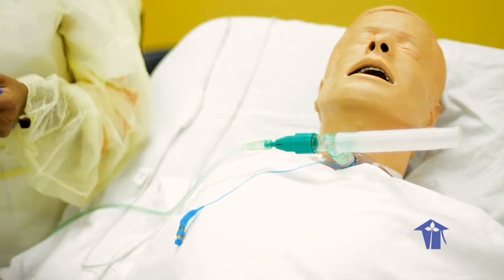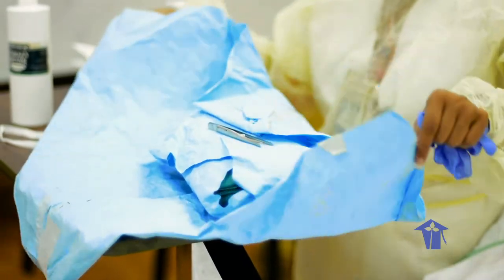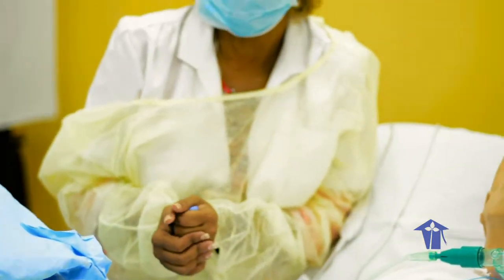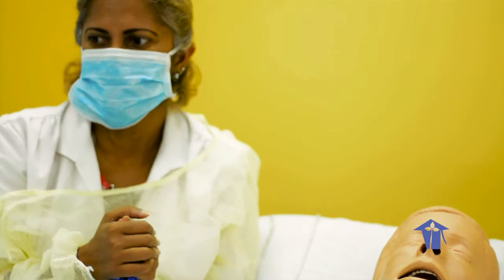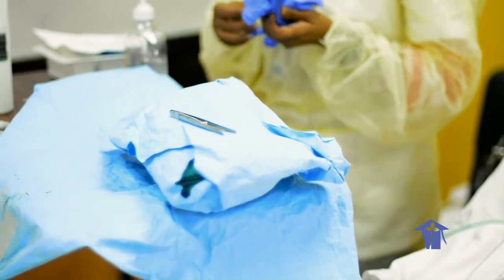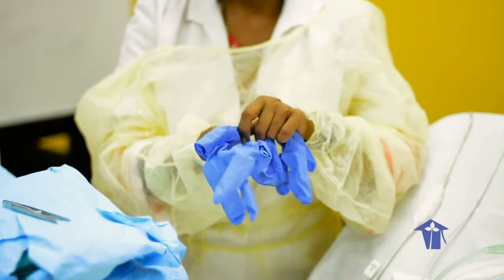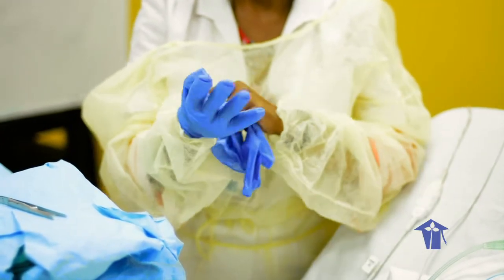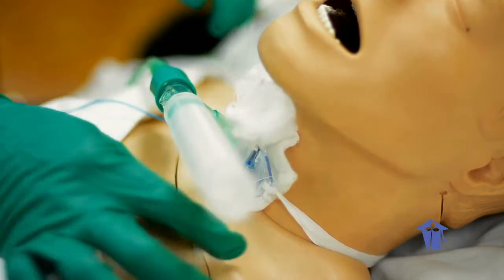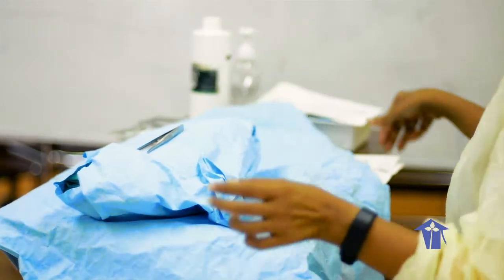Carefully open the package with the new disposable inner cannula, taking care not to contaminate the cannula or the inside of the package. Mr. Black, we're not going to change the inner cannula today. As I said before, we're just going to clean around your dressing because that's all that's required. Put on disposable gloves. Remove dirty dressing by dirty nurse. Sterile nurse prepare a sterile package.